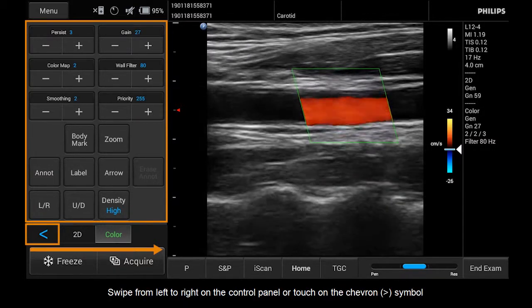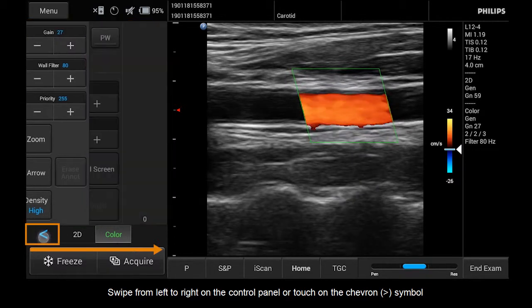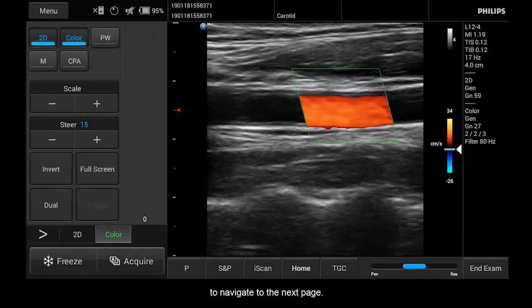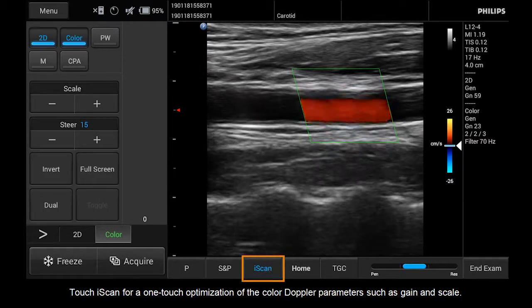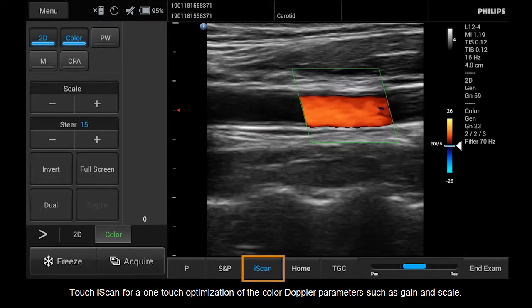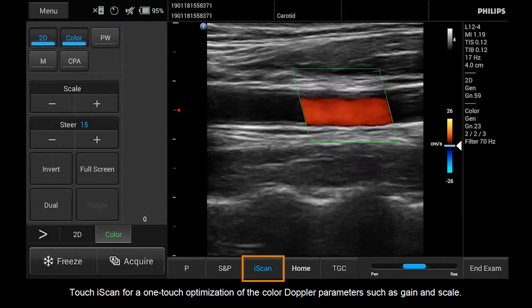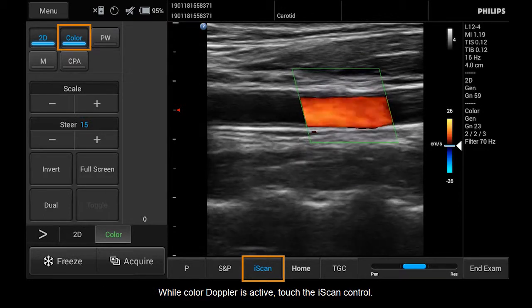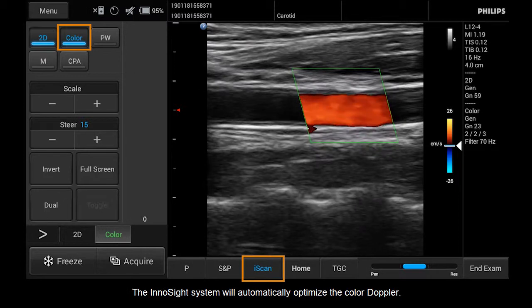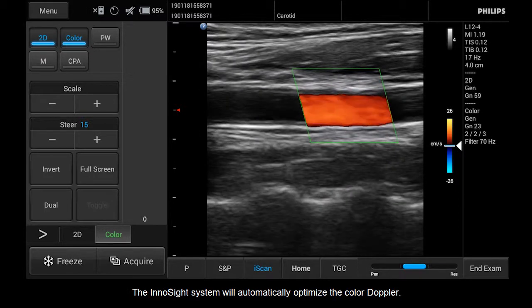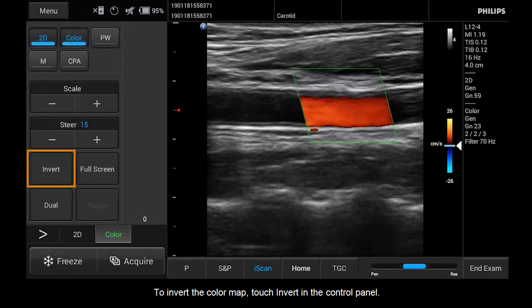Swipe from left to right on the Control Panel or touch the Chevron symbol to navigate to the next page. Touch iScan for one-touch optimization of the Color Doppler parameters such as Gain and Scale. While Color Doppler is active, touch the iScan control and the InnoSight system will automatically optimize the Color Doppler.